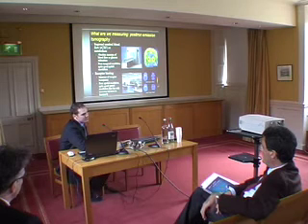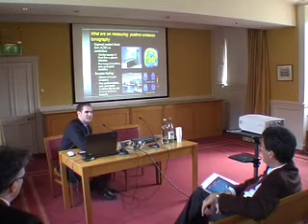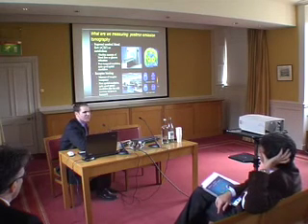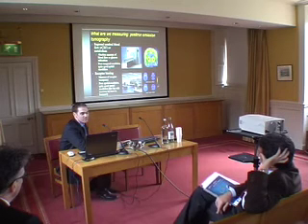So there's a very beautiful set of images here which I rather like, looking at healthy volunteers who were either family positive or family negative for alcoholism, and you can see that even in subjects who aren't suffering from alcoholism themselves, there's a difference in the brain chemistry in this area called the caudate in terms of the dopamine system. So that's something we can still only really do with PET.